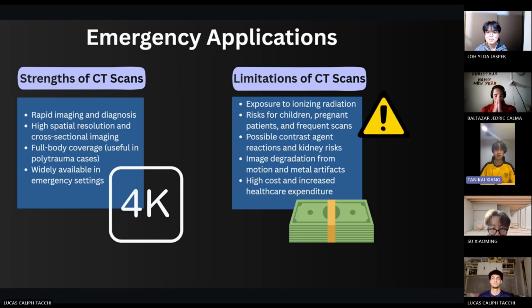However, it also has its limitations, such as exposure to ionizing radiation, possible contrast-related risks, and image artifacts from motion or metal. These factors must be considered during clinical decision-making.